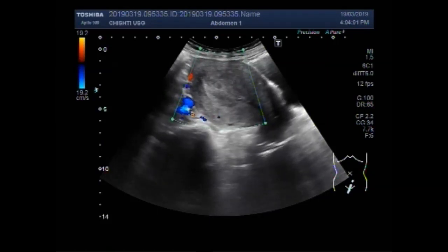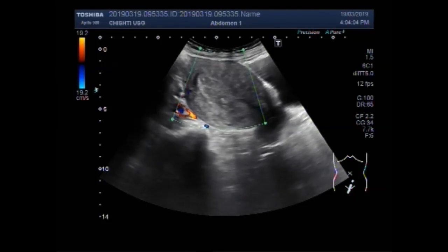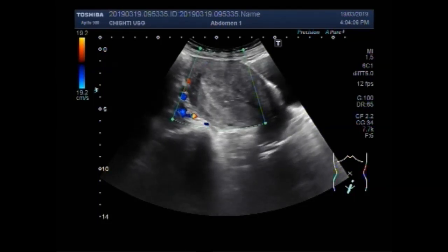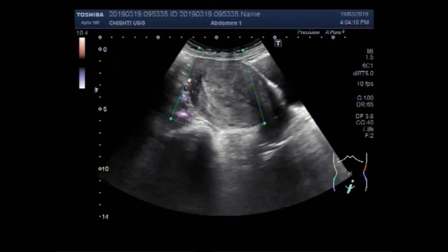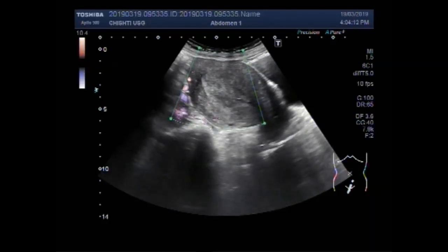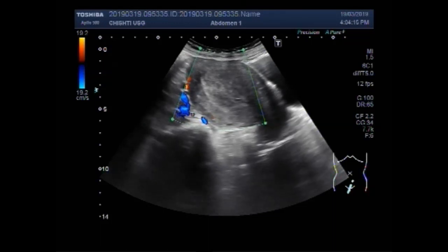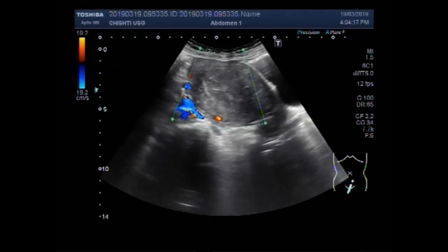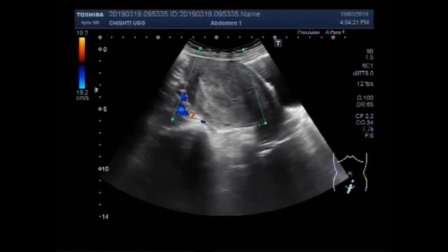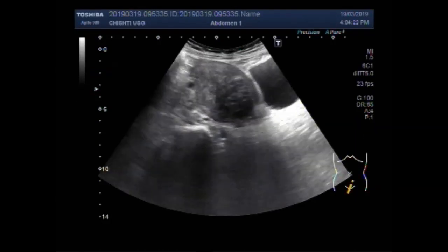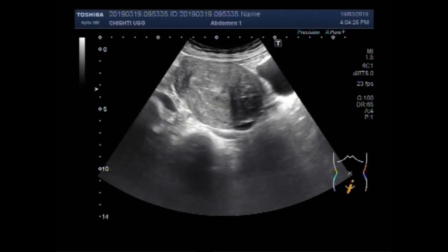You can see a little blood flow is seen inside the polyp. Only feeding vessels are visible. You can see the mass has even ecogenicity.